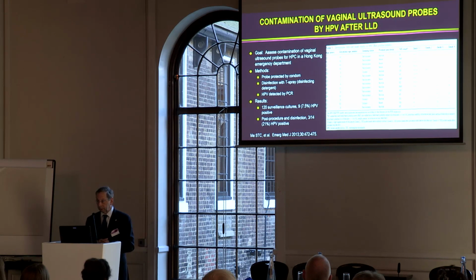So again, the problem is that after low-level disinfection, even with the probe cover, can lead to contamination of the probe, and this will potentially lead to transmission with, again, results years later when a woman could develop vaginal cancer.